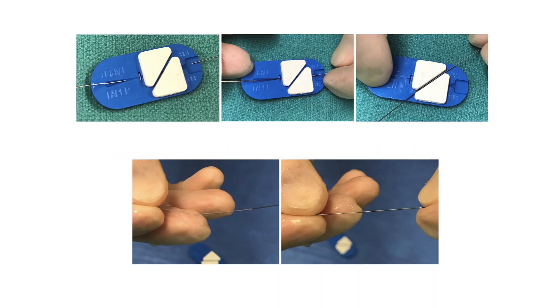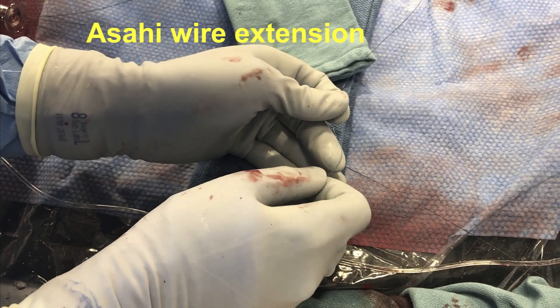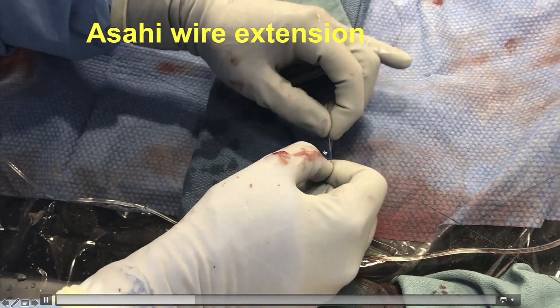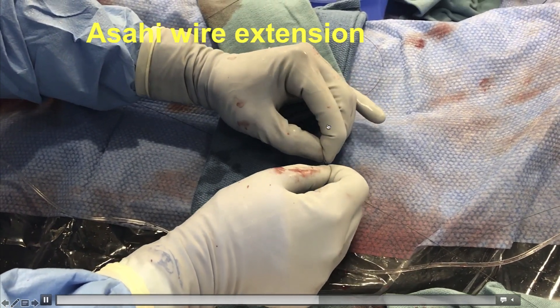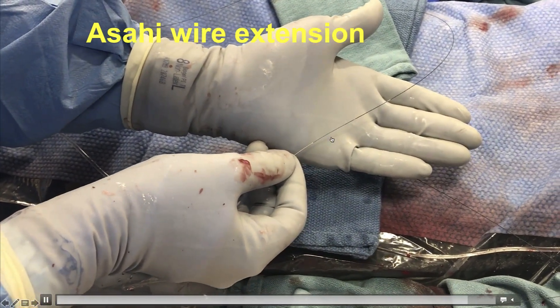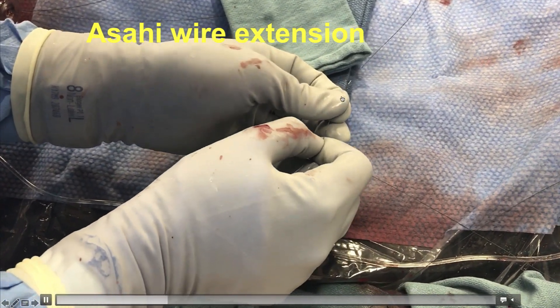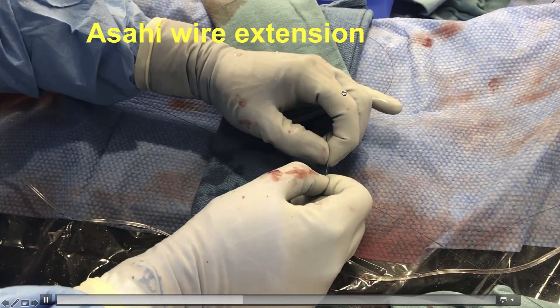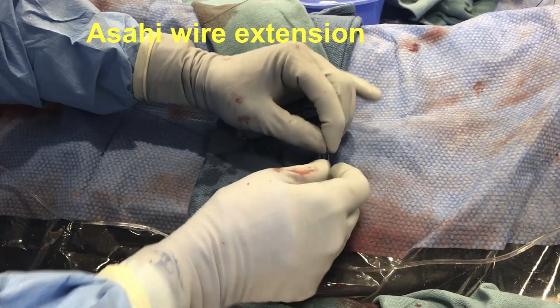The next option is to use a guide wire extension. Each company has its own guide wire extension, and it is important to have the specific extensions for the different types of wires. The extension is an extra piece of guide wire that fits on the back end of the wire still in place. It is important to advance it as far as possible to ensure the connection is secure. After doing that, we have converted our short guide wire into a long guide wire, and now we can remove the microcatheter under continuous fluoroscopy.